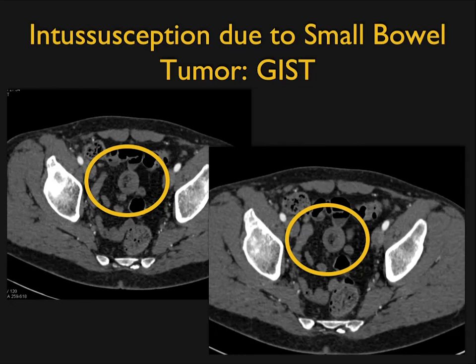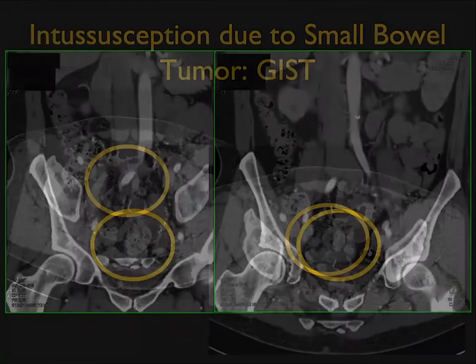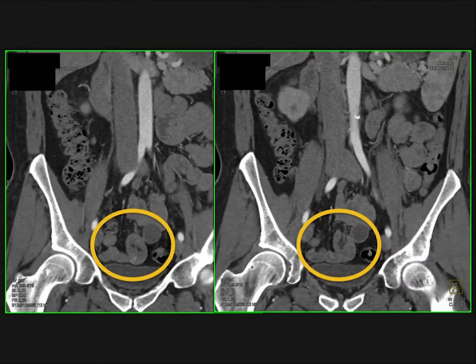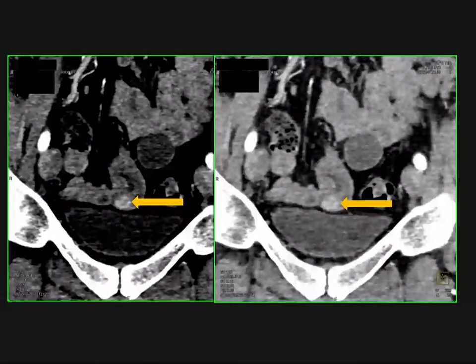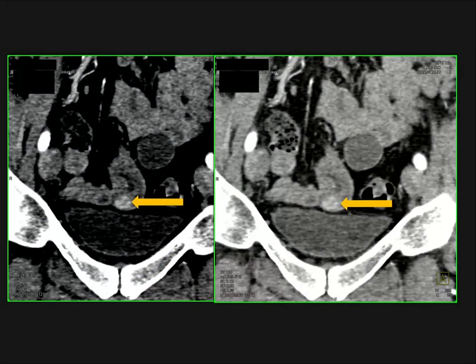I have seen a couple of cases with intussusception as a presentation. You can see the intussusception in the lower pelvis on axial view. On the coronal view it's a small and intermittent intussusception, but if you look carefully and narrow the windows, you see a 1 cm mass at the arrow that was causing the intussusception.